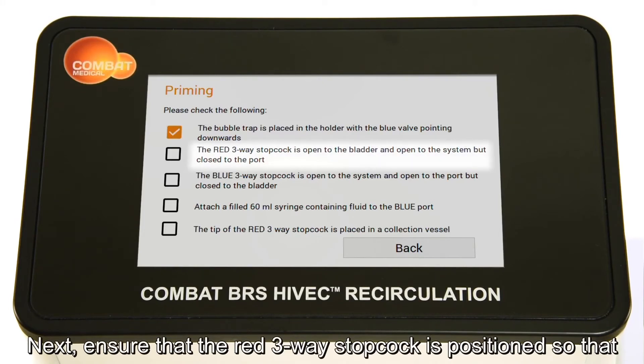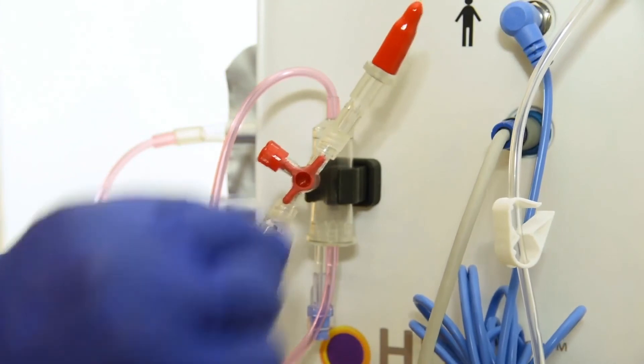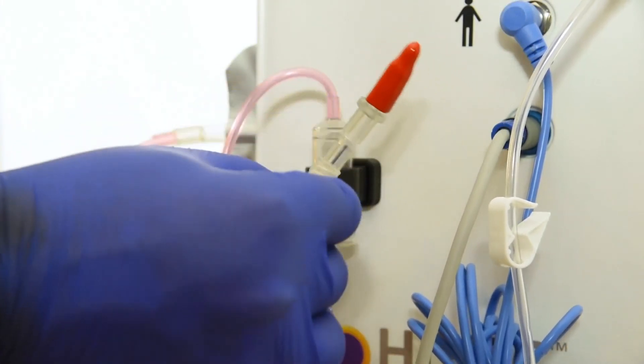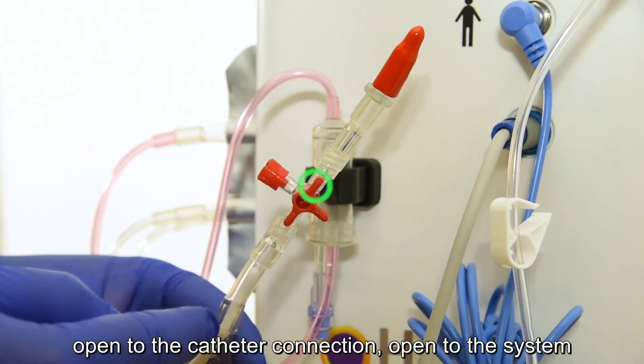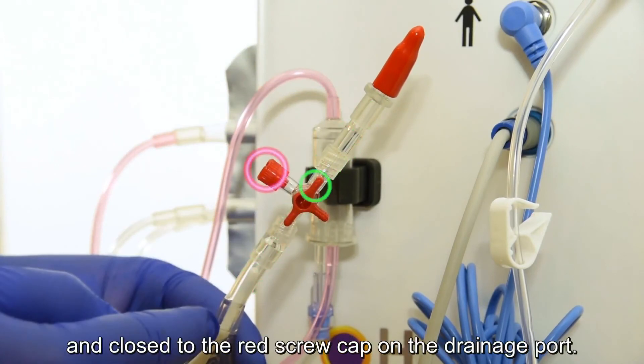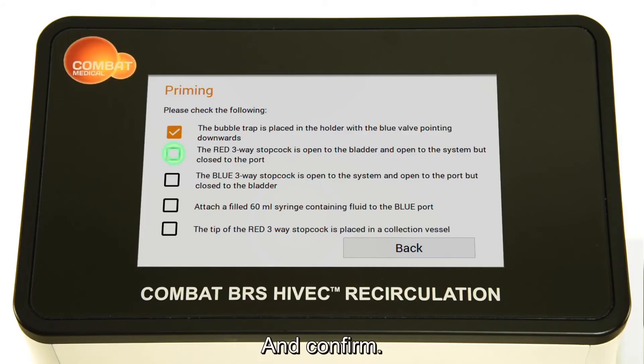Next, ensure that the red three-way stopcock is positioned so that it is in line with the tubing. Open to the catheter connection, open to the system and close to the red screw cap on the drainage port. And confirm.